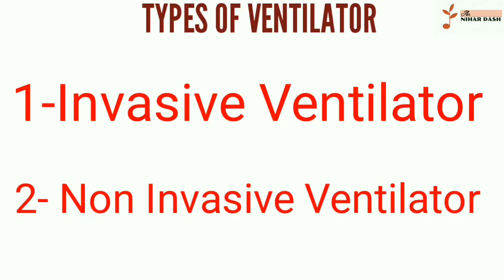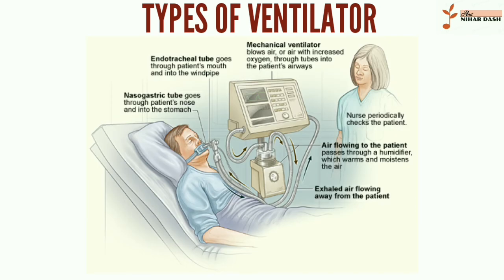Types of medical ventilators: invasive and non-invasive are the main 2 categories. Invasive: a tube is either placed into the patient's airway or is inserted through a hole made in the neck. These ventilators are also called mechanical ventilators, and they take over breathing for the patient entirely. They are used when the patient is unable to breathe on their own or requires extra help to breathe efficiently.